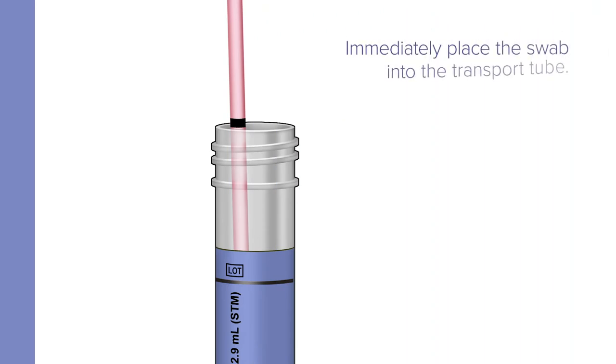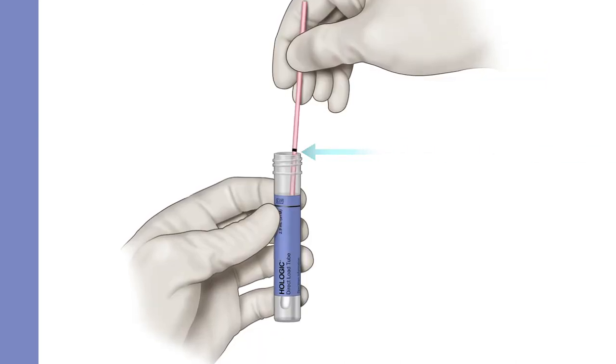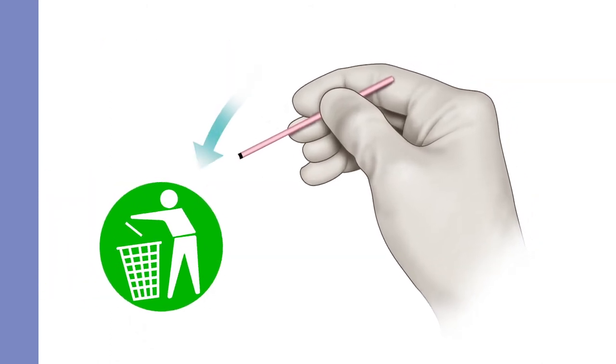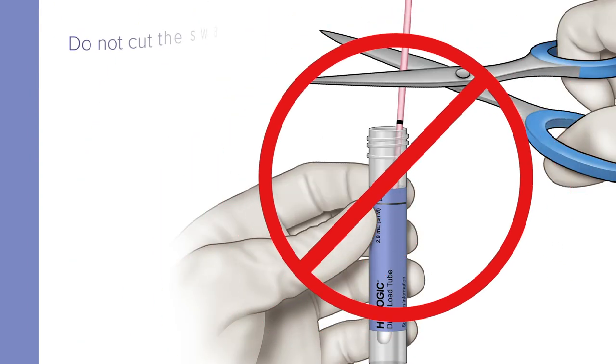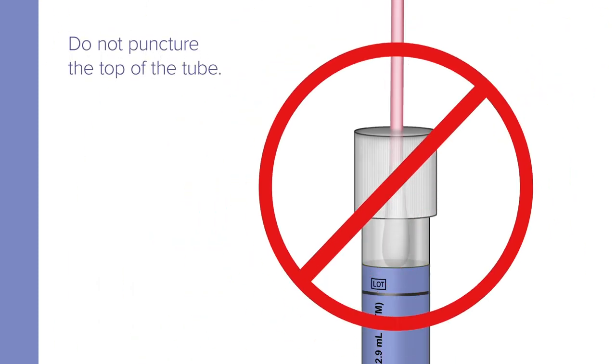Immediately place the swab into the transport tube so the black score line is at the top of the tube. Align the score line with the top edge of the tube and carefully break the shaft. Discard the top portion of the shaft. Do not break the shaft above the score line, do not cut the swab, do not fold the swab in half, and do not puncture the top of the tube.